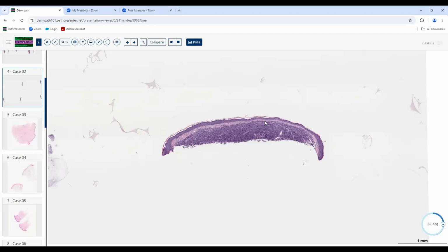And notice that there's no involvement of the epidermis. There's a Grenz zone between the epidermis and this pathologic process. In low magnification, basophilic cells, kind of hard to be sure exactly what they are, but notice over here there may be a few little nests. And so at low magnification, say, well, we're not positive what it is, but maybe it's melanocytic. So we'll just see when we go to higher magnification. But at low magnification, it kind of looks benign.